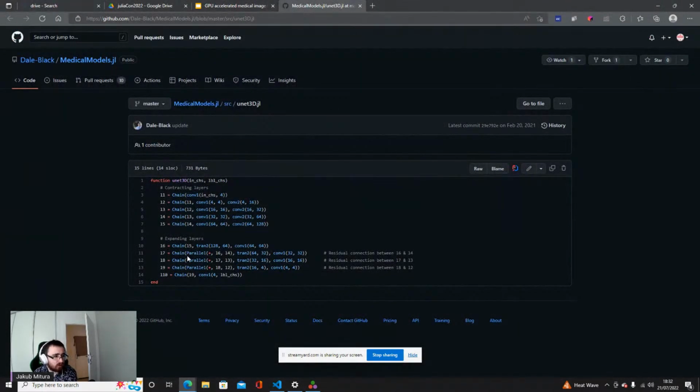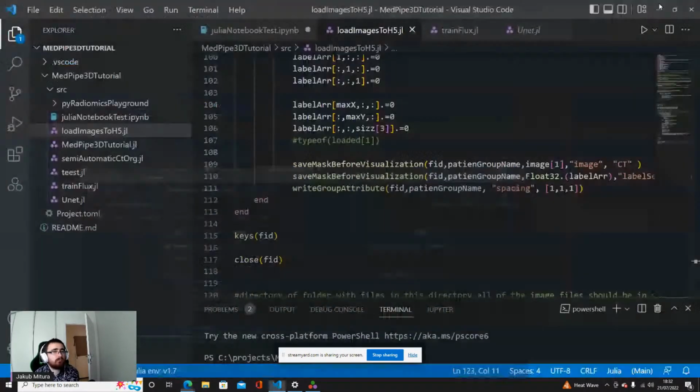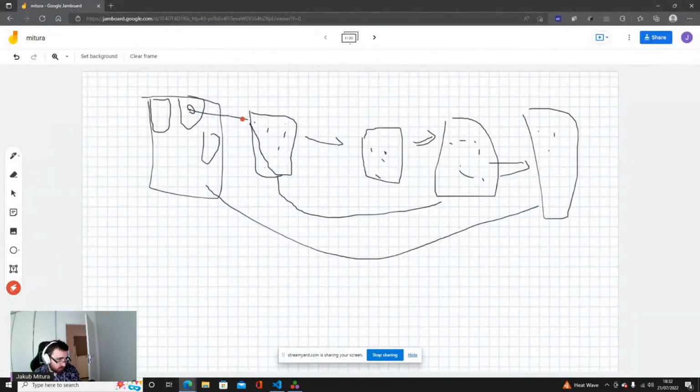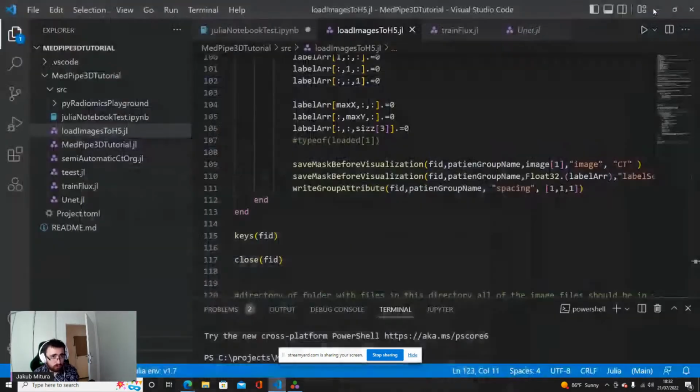And you can see these skip connections here, residual connections between 16 and 14, for example. And one more thing, this is also because of these poolings. This is also why I created this to be divisible by 64, because in my case I created 4 layers, 4 poolings, and in order for it to play well, it needs to be divisible by 2 by 2 by 2 by 2. So in the case of 64, it worked better.